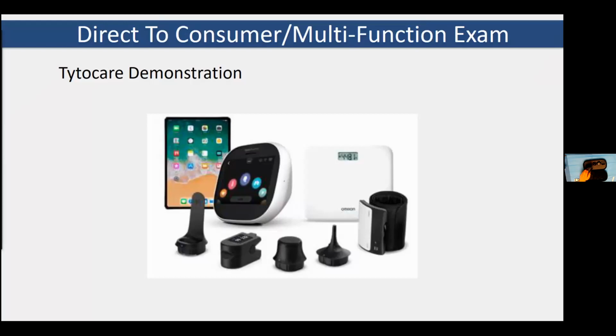First off, we have the device itself, and built into the housing of the device, we have a few different sensors. There's a thermometer, a temperature sensor here, and then the basic exam camera is built into the device as well. In addition to the functionality built right into the housing, we have a few different lenses that we can apply to this. They mount with just a little magnetic mount. You take it and slide it on.